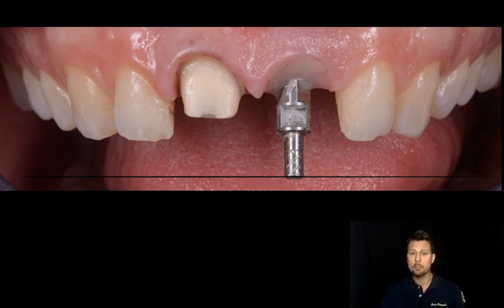And as you see, I also placed some flowable around the transfer. Why? Because this flowable composite allows me to have less contraction of this amazing architecture that we built over the past months. So I don't want to lose it, and I block it, putting some flowable composite around the open tray transfer.